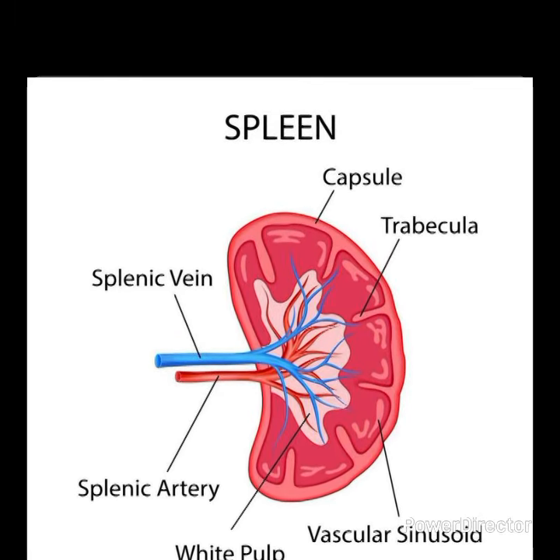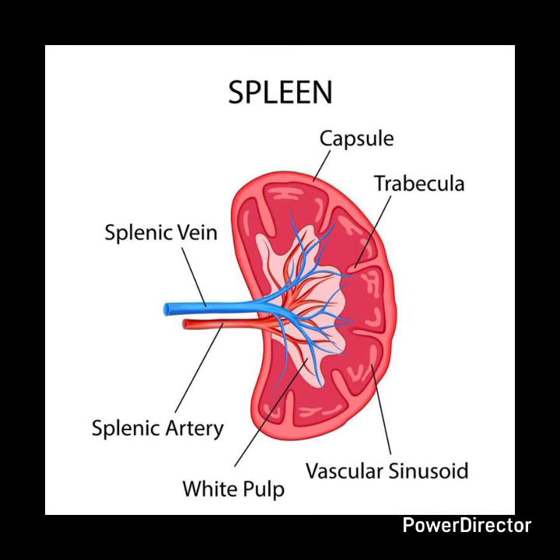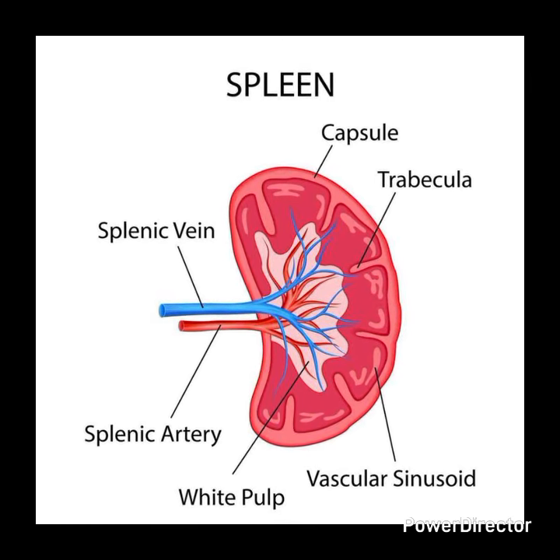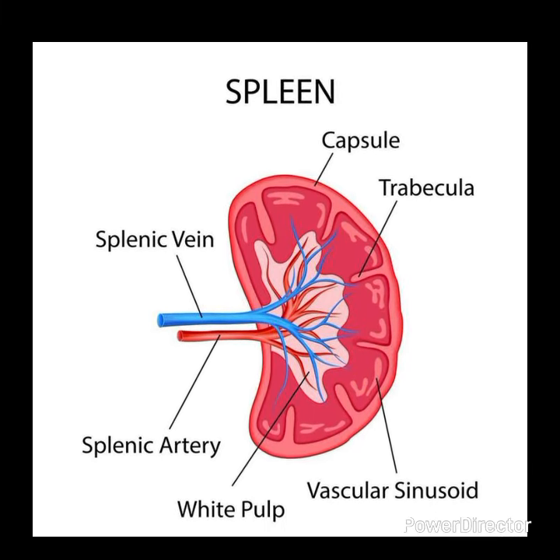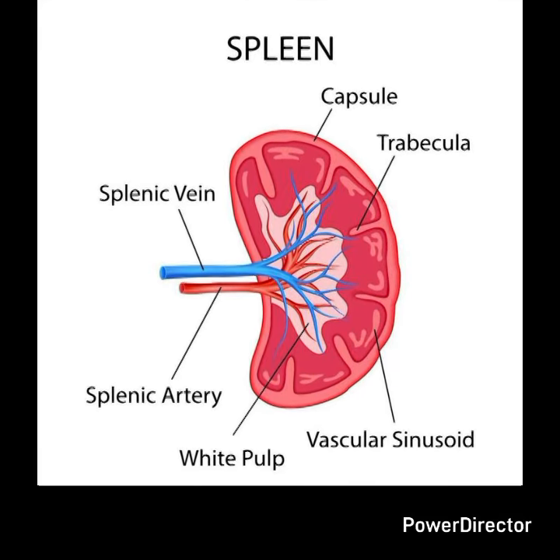In proximal splenic artery embolization, the splenic perfusion is maintained through collateral pathways. In distal, there is a higher risk of splenic infarction. Next one is combined embolization. It combines proximal and distal techniques to address complex injuries, though it may increase complications like abscess formation.